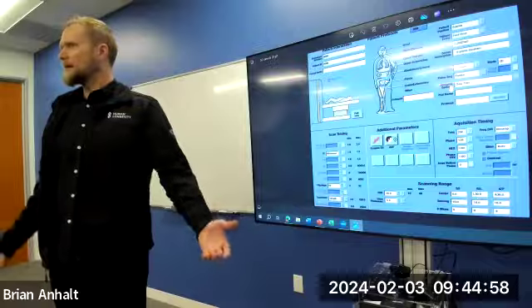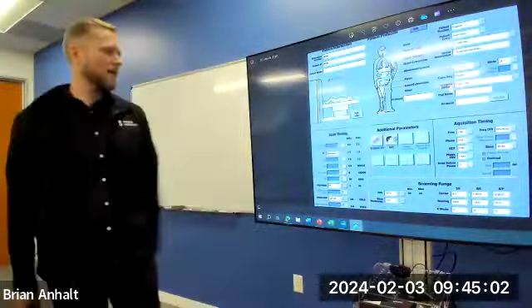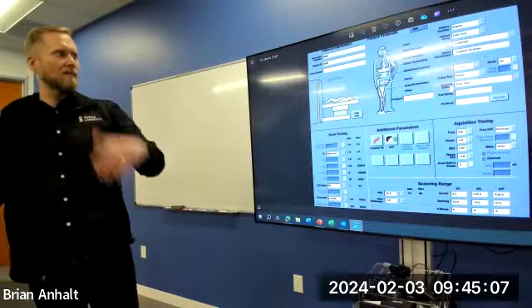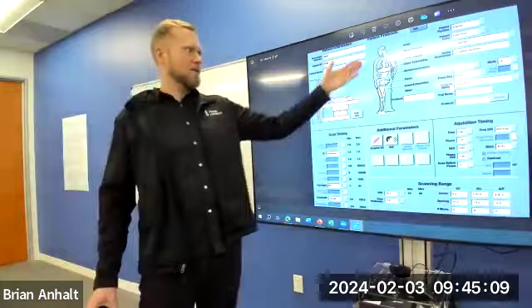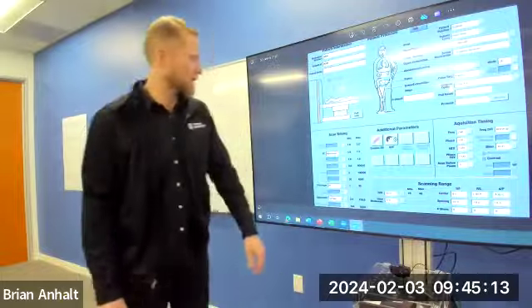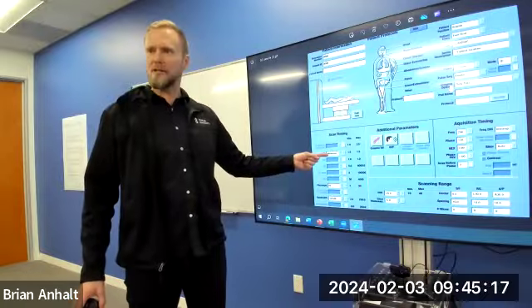Makes sense what they did because there's a lot more options and stuff as opposed to clicking on different things and pulling up other sets of parameters. It's all kind of laid out in between tabs, but I like to pull up this old one because you're going to see all these different parameters that are on here. All right, so ones we're going to talk about today, I'll pull this back and forth, but you see, got a TE right here that we can change, right?